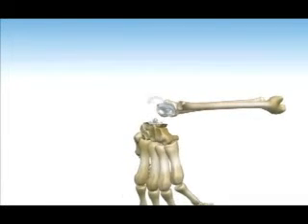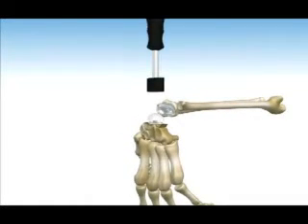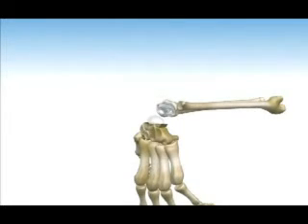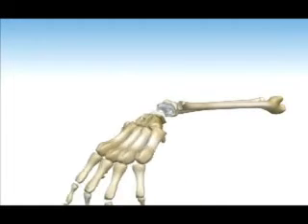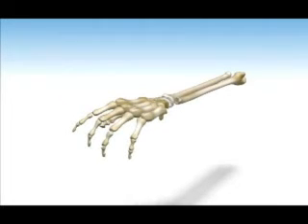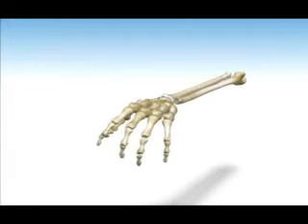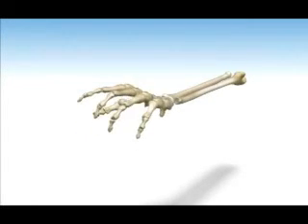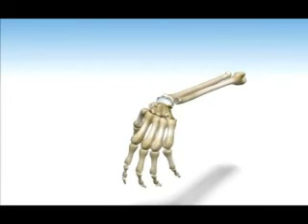The polyethylene carpal ball is now placed onto the distal component and snapped into place using the carpal ball impactor. The total wrist joint is articulated and stability assessed. An extra-length polyethylene ball may be indicated if there is residual dorsal palmar laxity or instability. Assess range of motion through radio-ulnar deviation and flexion-extension of the wrist. If range of motion is satisfactory, standard wound closure is performed at this time.